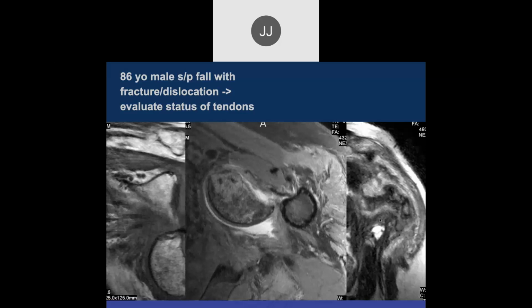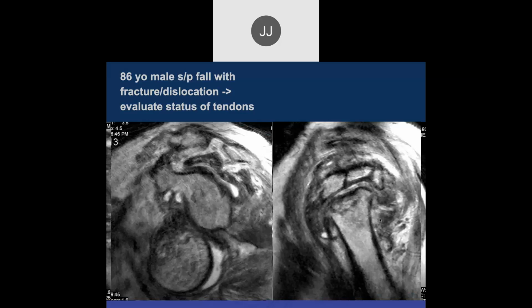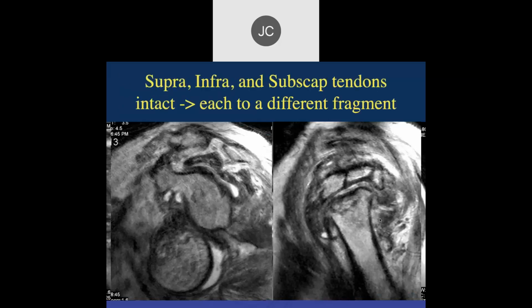Yeah. So I can't really make out much, honestly. It turns out you need the whole study to evaluate this, but if you then follow the tendons, it turned out each of these tendons went to a different displaced fragment in this particular case. But yeah, this is a very tough case.